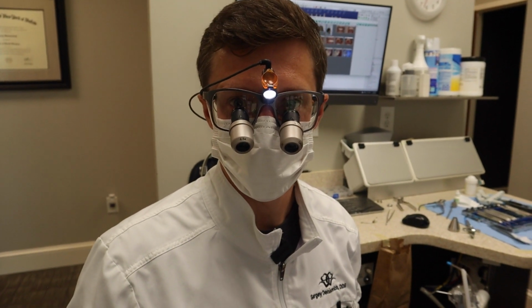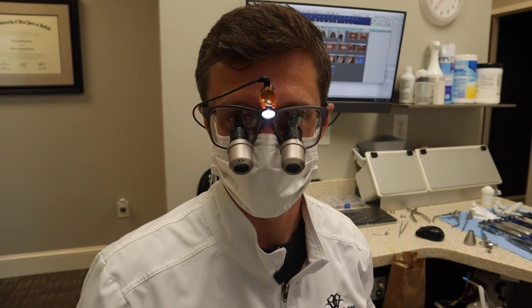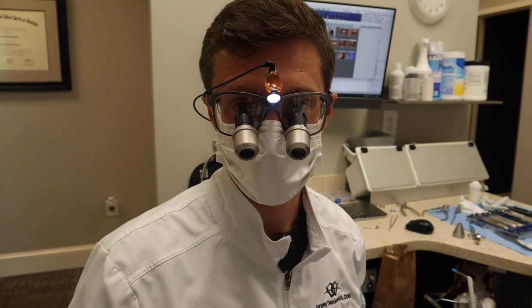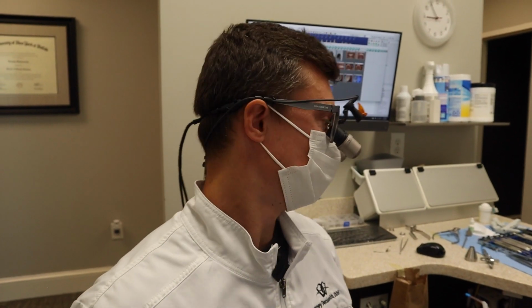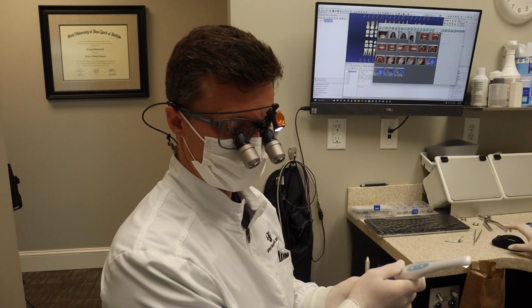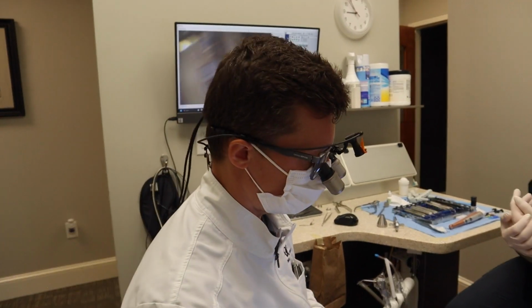Ever wondered as a patient what in the world the dentist is doing and drilling in your teeth and what he's seeing? So here we go. This is a perfect example of communication between the patient and the doctor with the intraoral camera to show the patient what their tooth looks like. And this is what we do every day.